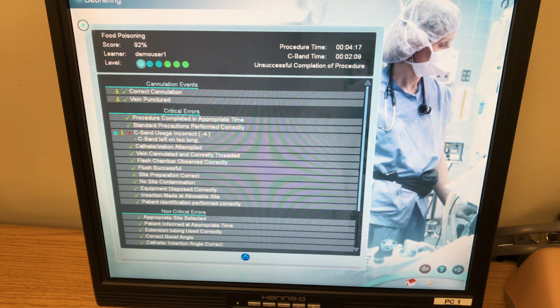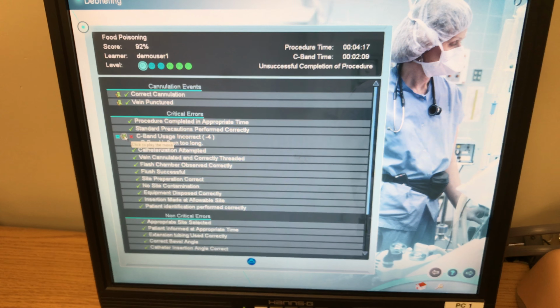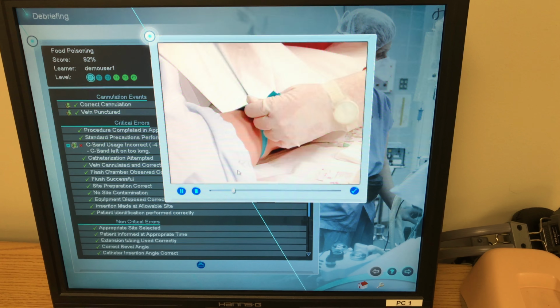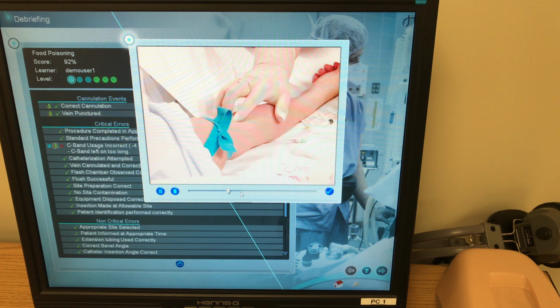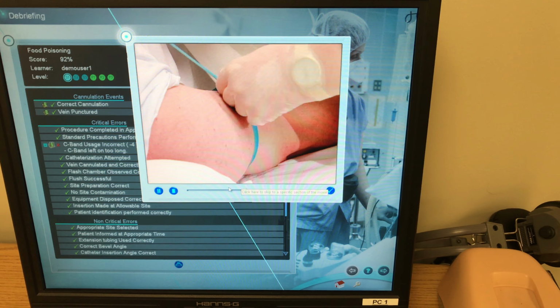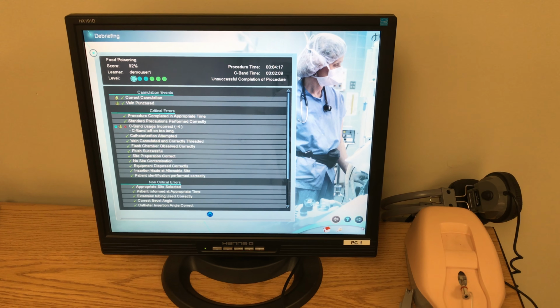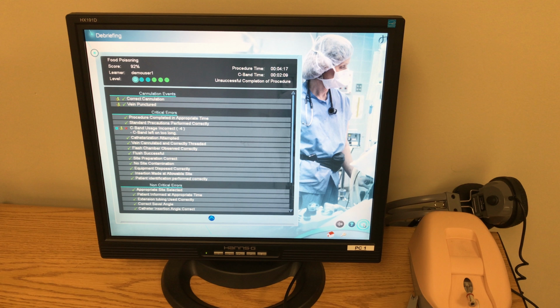But as you can see, it'll tell you. And then for something that you did wrong, if there's a little movie clip here, you can click it. It'll play the movie to demonstrate what you did wrong. You'll have your headphones on, of course, so you'll be hearing the audio as it's going, but it'll explain to you what you have done wrong. So then the next time you try it, you know how to fix that problem. Okay, and then once you've completed this, and you've got your 90, or you've done it one time and you're done, you just click through.